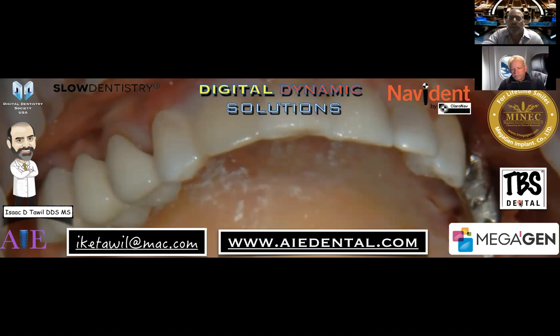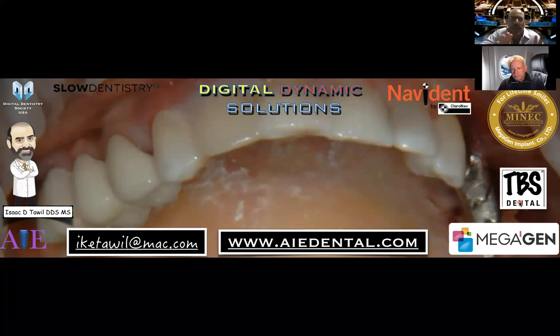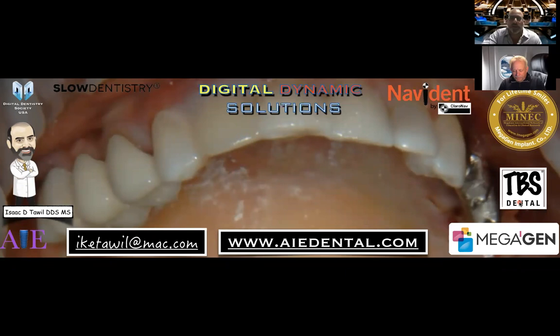If you want to use xenograft as an additive, I'm not saying not to. Certainly, you want to veneer the buccal after you've osteodensified a site, and veneer the buccal for an augmentation, or you want to add it into the sinus, there's no issue with that whatsoever.